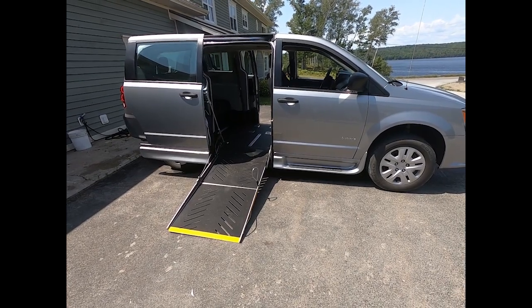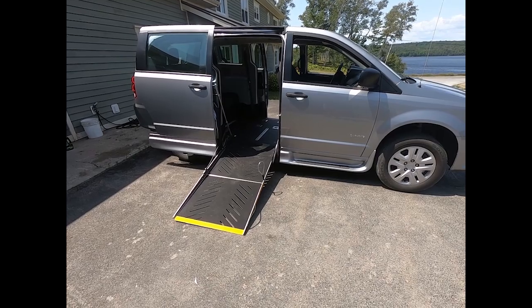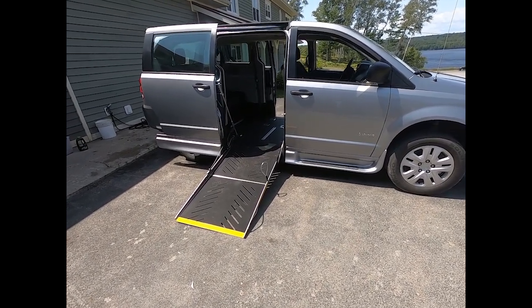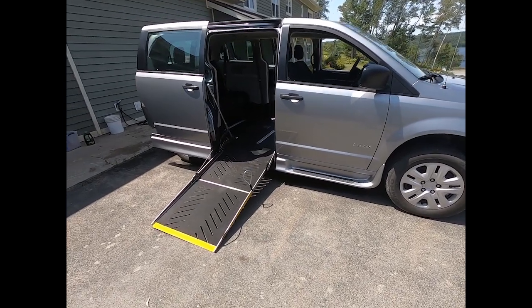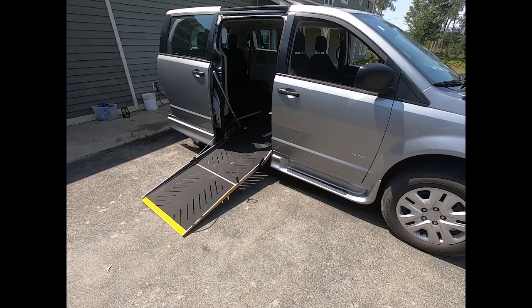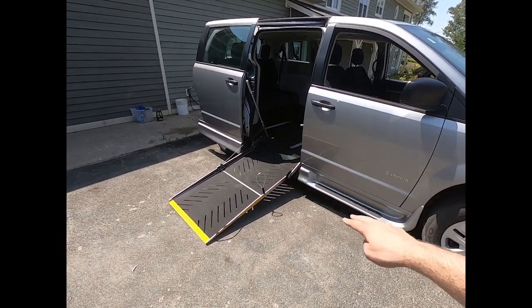So this particular client wanted us to engineer a manual system to open and close the ramp, as opposed to having an electronic system. We came up with this on our own and wanted to show you guys how it works. As you can see, it is a manual van with a manual door and manual ramp.